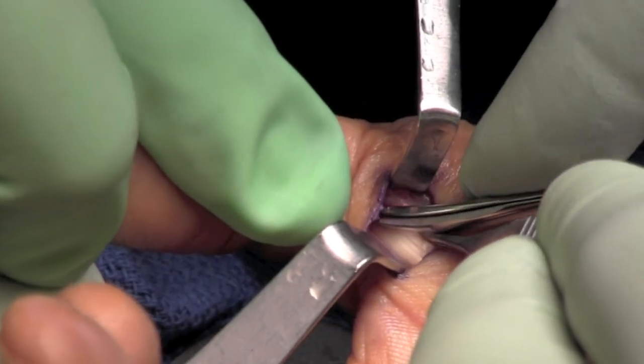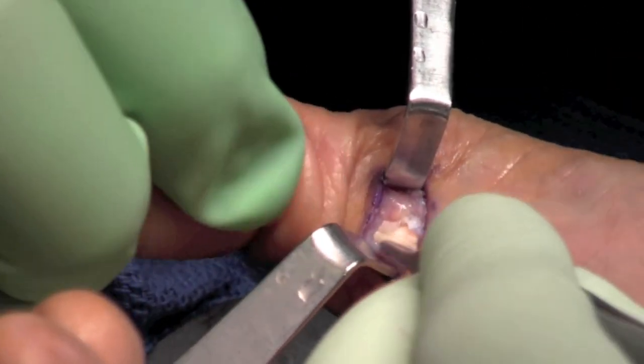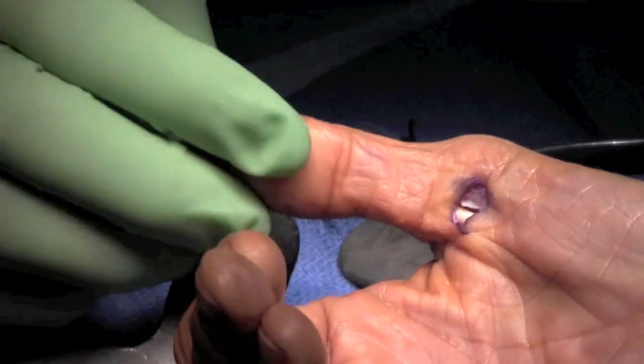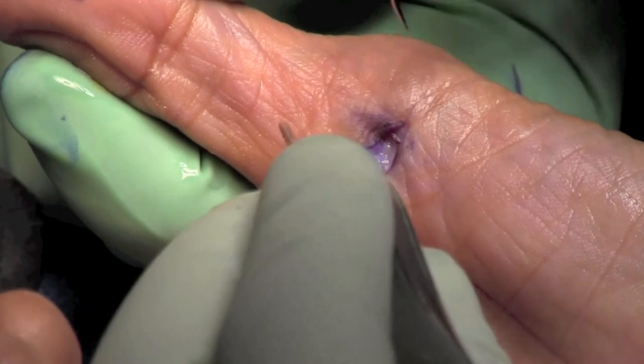Any residual catching or triggering noted with active flexion is then released. Here again we can see smooth motion of the tendon itself.